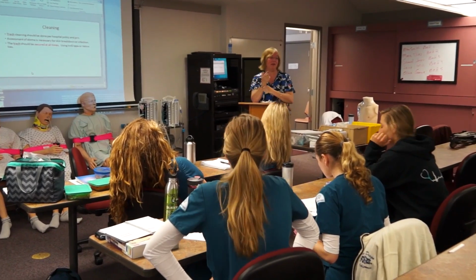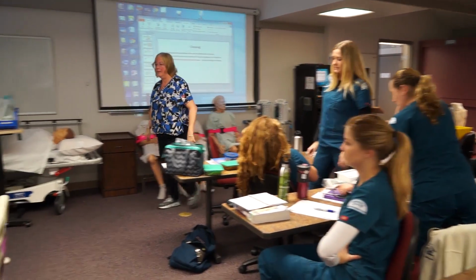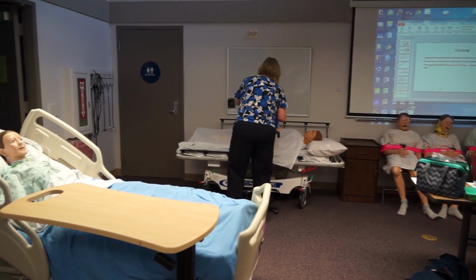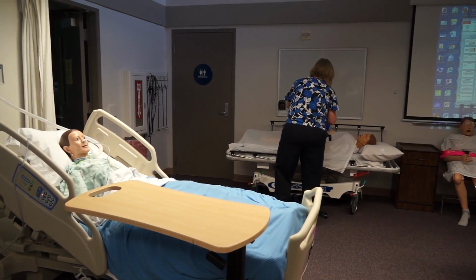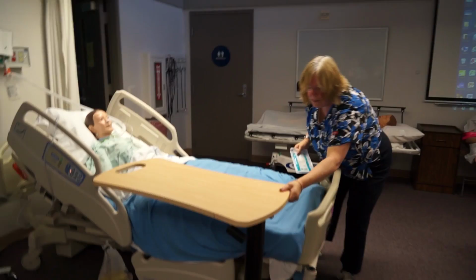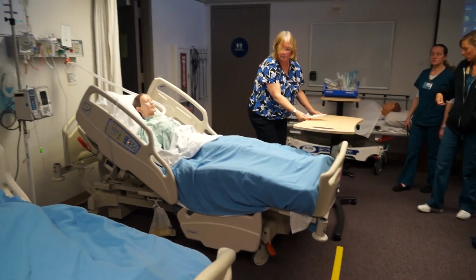We're going to come to the bedside. I'm going to show you guys how to suction real quick. Then we're going to be done. Let me get a suction kit. So when you come to the bedside, you guys are going to need a suction kit. And we're going to do this real quick.